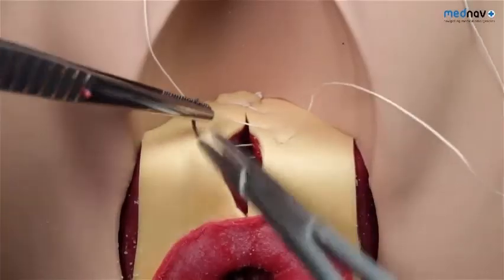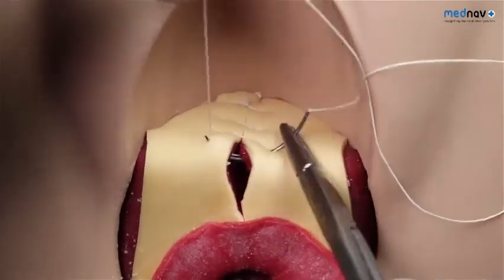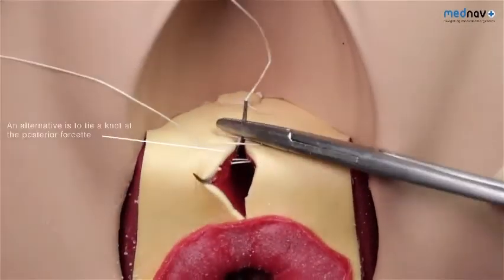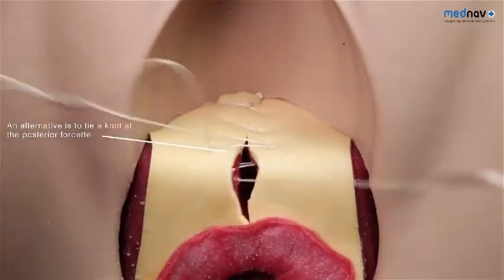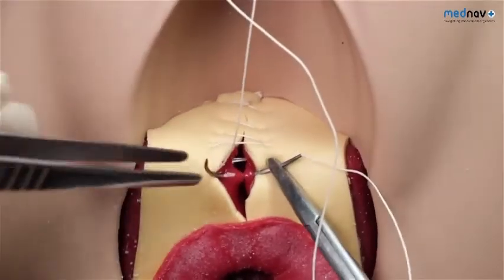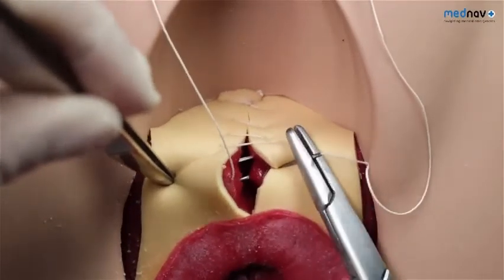A swab or tampon can be inserted into the vagina to remove excess blood to help identify the apex, and it is important that you remove this at the end of the procedure. Place and secure the first suture 5mm above the apex to secure any vessels that may have contracted above the tear. Repair the posterior vaginal wall with a loose, continuous, non-locking suture from the apex to the fourchette or hymenal remnants. Then insert the needle back through the skin at the fourchette and back through the vaginal mucosa to exit in the centre of the perineal muscle tear. Approximate the perineal muscles — the bulbospongiosus and the transverse perineal muscles — using a continuous, non-locking suture. Depending on how deep the tear is, two layers of sutures may be required.